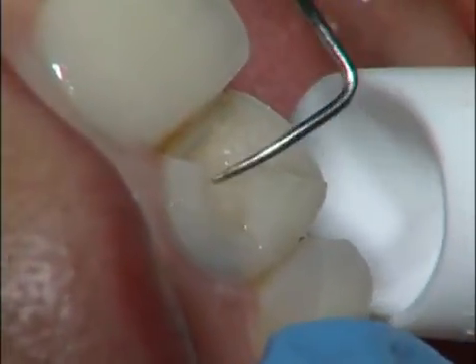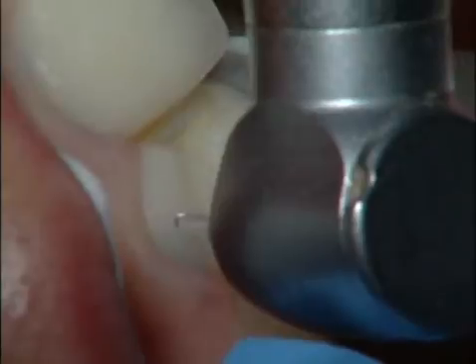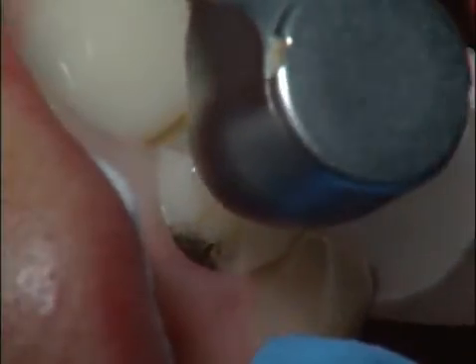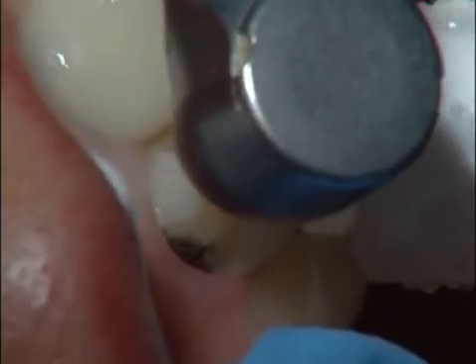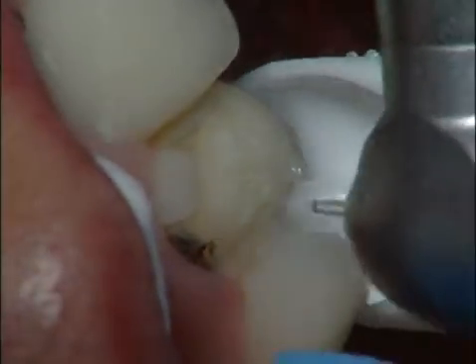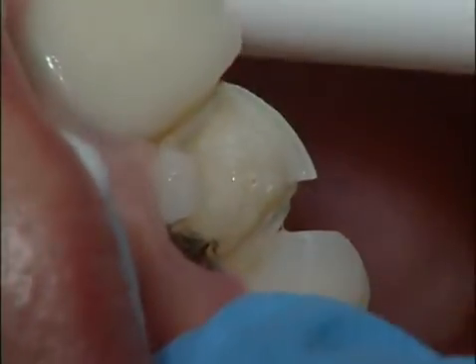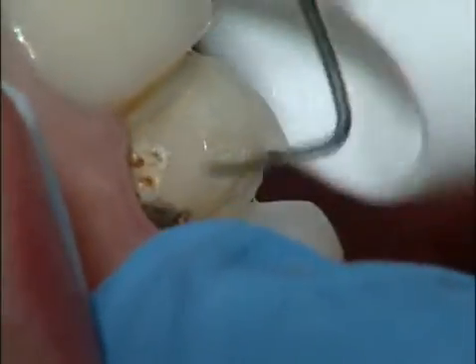Not always, but occasionally in removing veneers, I can anesthetize the tooth. Occasionally, because of the work that I have to do with the air turbine or electric high speed, patients are a little bit sensitive and I've had to give a little anesthetic. If I can't do the rest of the veneer prep or reprep with the laser, I'll feel free to offer the patients a shot. Obviously, we need to do what's necessary to maintain the most comfort for our patients.